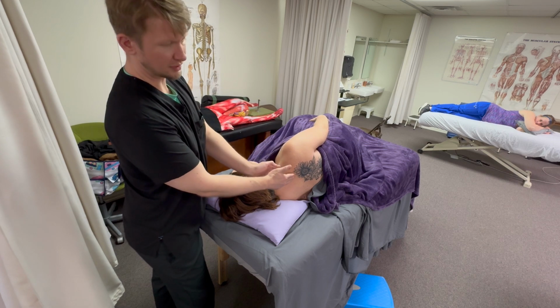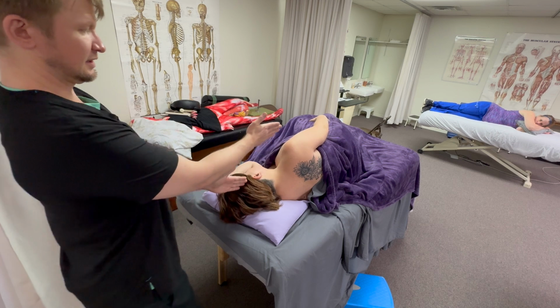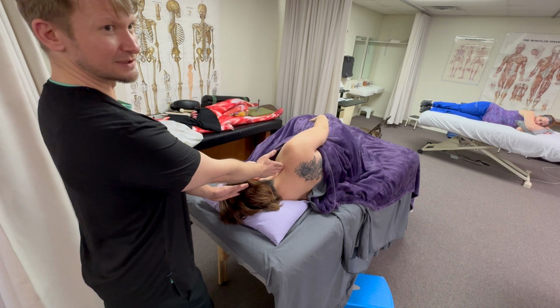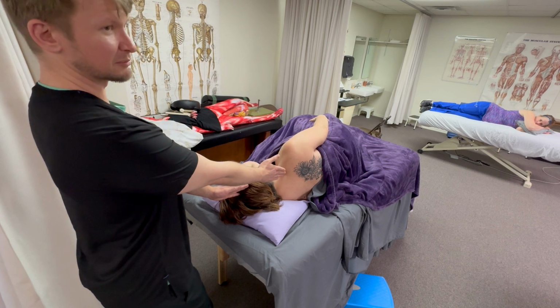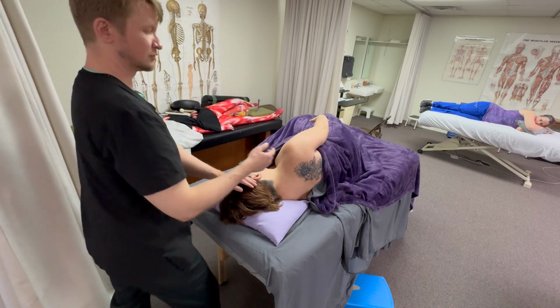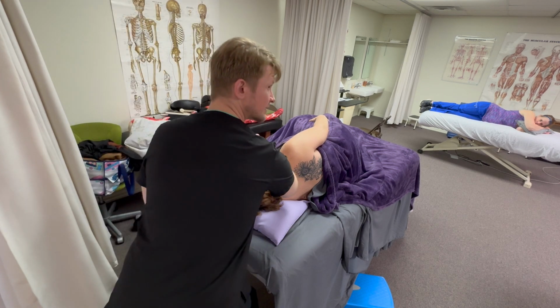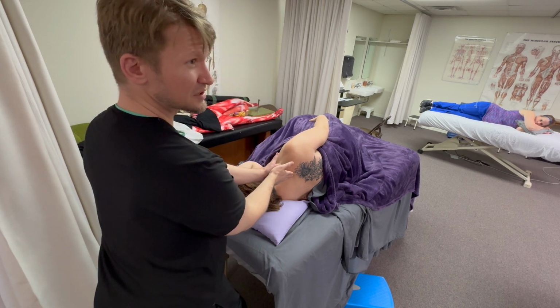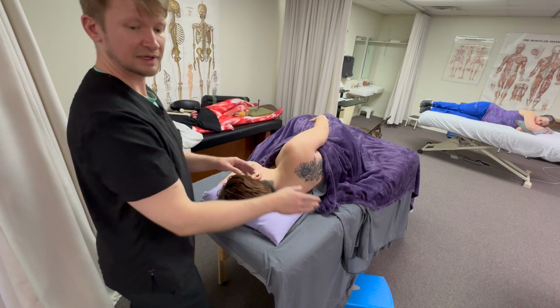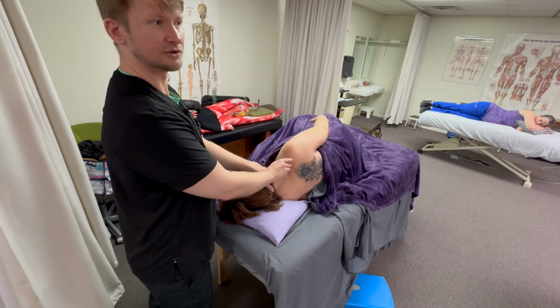These muscles start a bit more posterior. Like when you line yourself up with the shoulder, if you were to go right at the midpoint, you're missing upper trapezius. You have to go just a little bit more posterior. This applies for when you're doing massage. That's why we don't massage like this. We step a little bit behind their head so that we're just a touch more posterior to be really on that particular muscle. That also lines us up with the supraspinatus underneath.